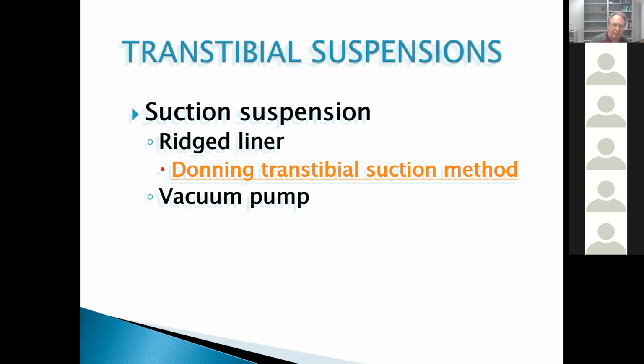A type of suspension that is much more current is the suction suspension. The suction suspension has been around with transfemoral for a long time, but is kind of new to the transtibial.